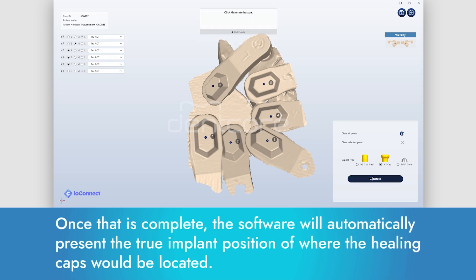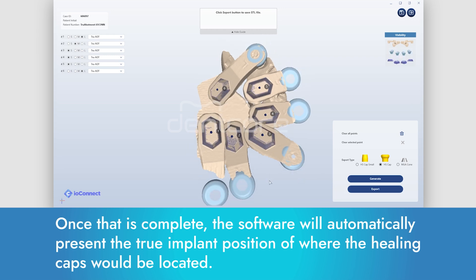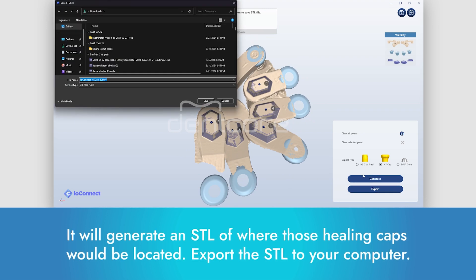Once that is complete, the software will automatically present the true implant position of where the healing caps would be located. It will generate an STL of where those healing caps would be located. Export the STL to your computer.